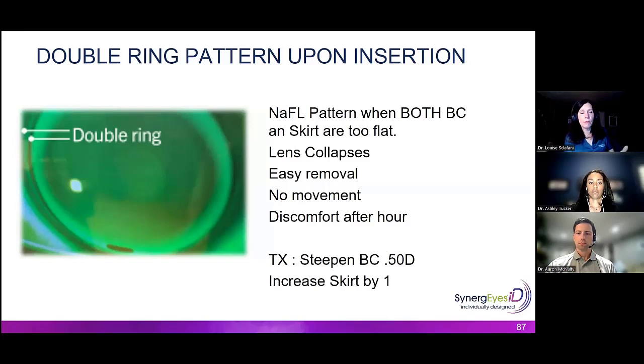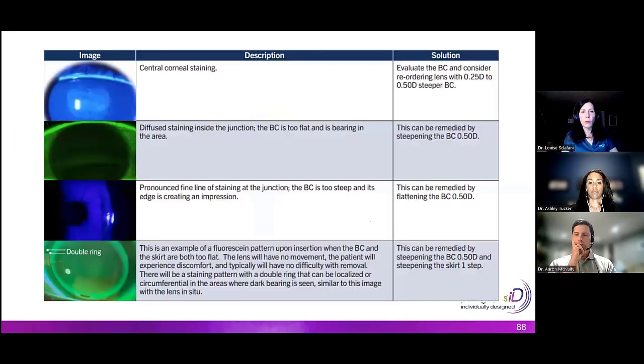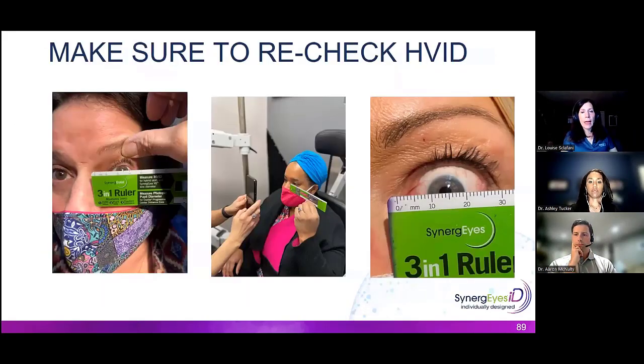It typically has minimal to no movement, but it gets discomfort pretty quickly. So both of these will have to change. And in that fitting guide that I talked to you about, there is a description of all these and how to fix them. And these are different methods of taking that HVID.